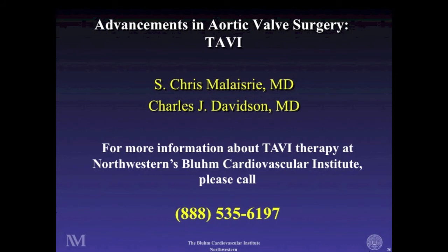There is a learning curve with this technology, as there is with pretty much any new technology, and there have been some guidelines that have been put out by the American College of Cardiology and the Society of Thoracic Surgeons for competency for these procedures and how many previous procedures you maybe need to have done. What this competency surrounds is the experience of the interventional cardiologist in treating patients with valvular and structural disease and having done a number of what we described earlier as balloon valvuloplasties prior to undertaking this treatment.